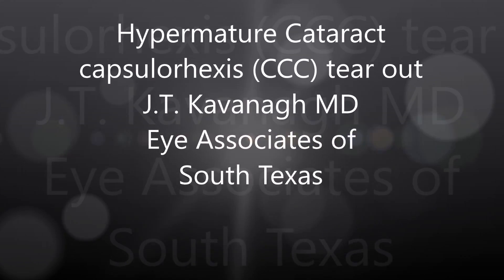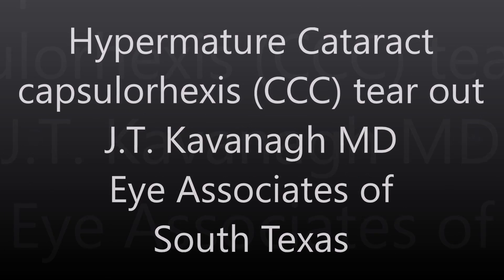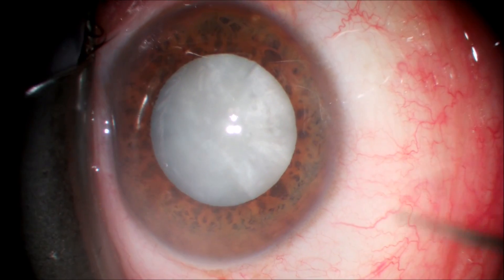This is Dr. Kavan of Eye Associates of South Texas. I'm going to show you a case of a hypermature cataract where we're doing a capsulorhexis and the capsulorhexis tears out.